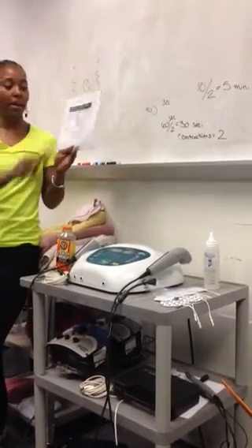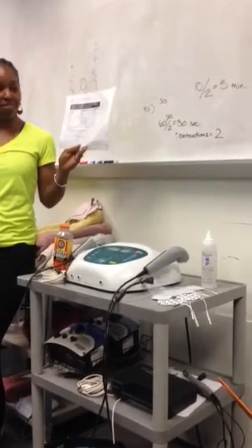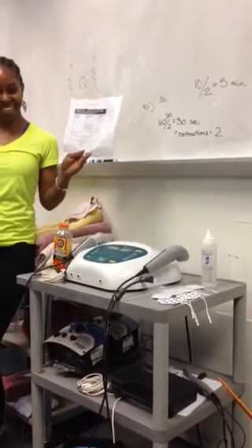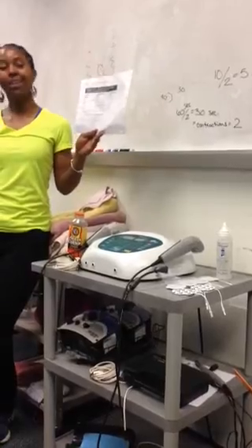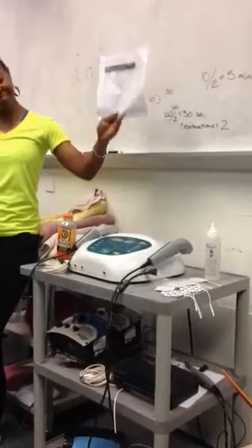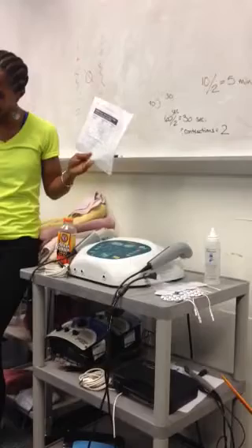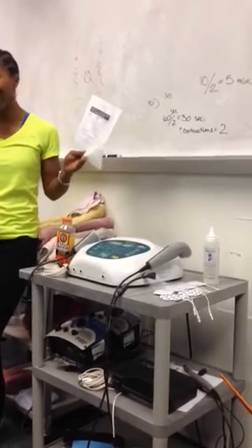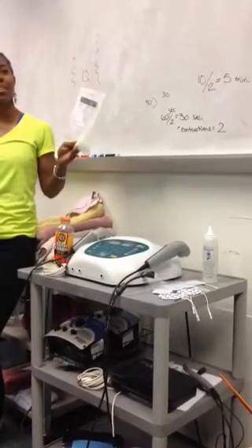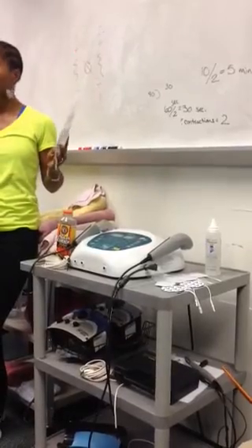Okay, 3 megahertz. 0.3, 0.6, 0.9, 1.4. Again, 0.3, 0.6, 0.9, 1.4. Say it one more time. 0.3, 0.6, 0.9, 1.4. That's what's, okay. He was off. So I was like, why is everybody together? Well, I don't want to say point every time. Okay, but don't forget there's a point in there.